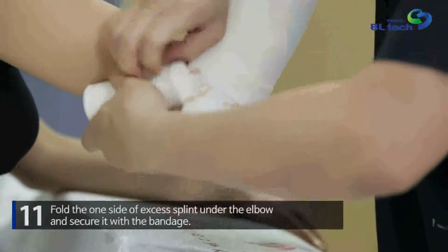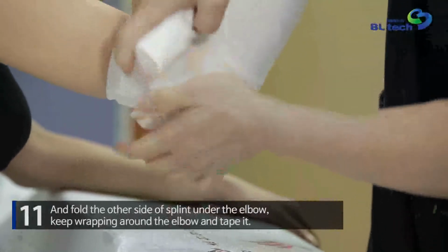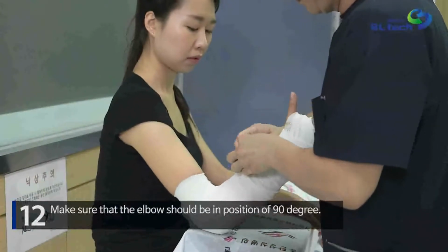Fold one side of the excess splint under the elbow and secure it with the bandage. And fold the other side of the splint under the elbow. Keep wrapping around the elbow and tape it. Make sure that the elbow is in a position of 90 degrees.